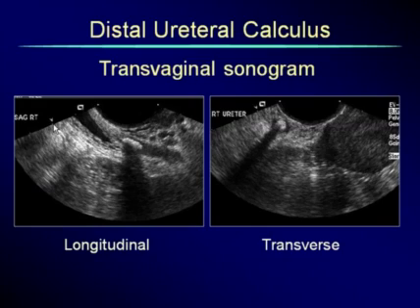Now, if we suspect that the symptoms direct us towards a possible distal ureteral calculus, transvaginal sonography is a very nice, sophisticated, elegant way of finding that calculus. And here it is. Here's the distal ureter with the shadowing calculus heading straight towards this collapsed urinary bladder on this vaginal scan. We turn on it. There it is, the stone. There's a little bit of the edematous mucosa around it.